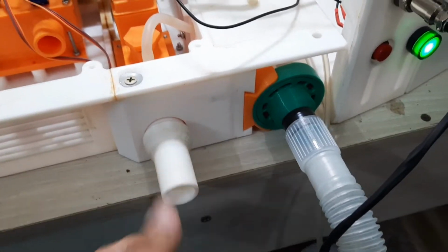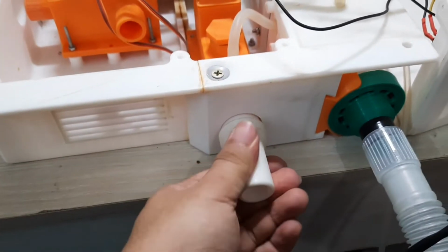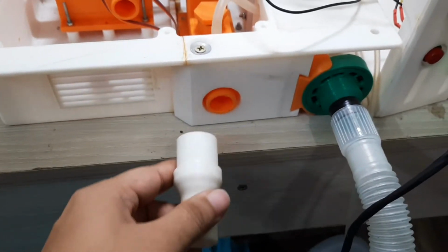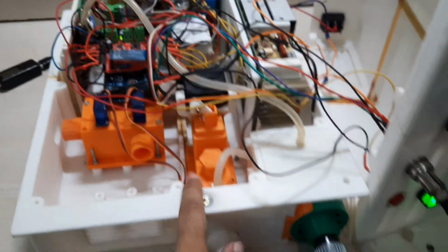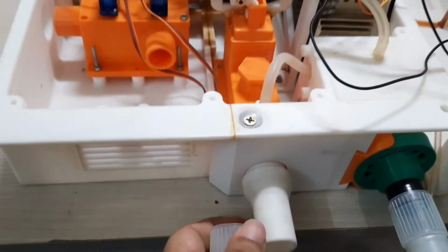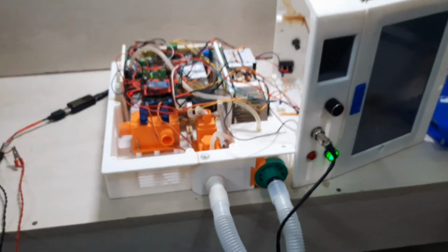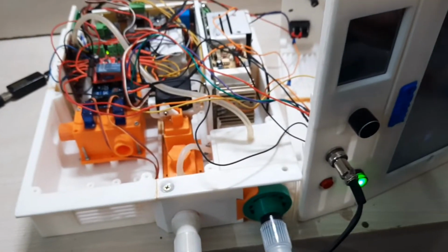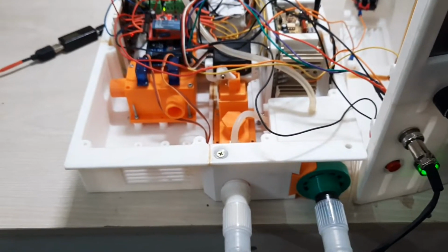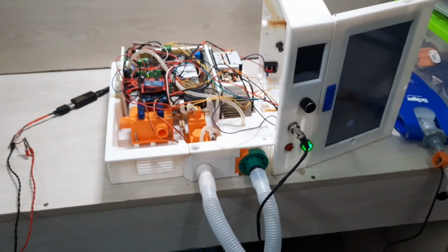If I remove it, the ventilator will detect the disconnection immediately. Here is actually the one-way valve. So the ventilator actually detects the disconnection, and now if I connect again, it will detect that I have connected here. So there are lots of alarms going on because I have disconnected the entire ventilator circuitry, the patient circuit.